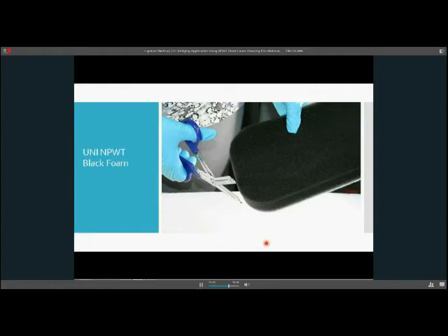Okay, now you're going to get a great pair of scissors. And you need to cut the foam to be the correct size, of course, of the wound. Couple little points. You definitely want to make sure that you're filling your wound and you're not leaving any dead space. But if you do have any undermined areas, if you do have any tunneled areas, you wouldn't be using the black foam. You'd actually be using the white foam. The white foam has a greater tensile strength. It also does not fray at all. So that way it's very good to go in those areas.